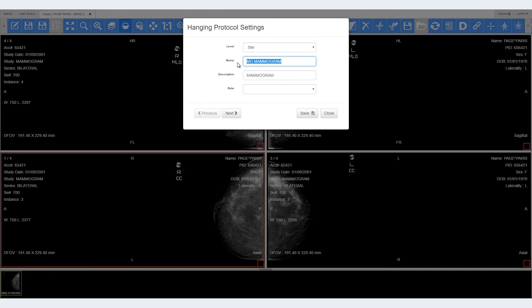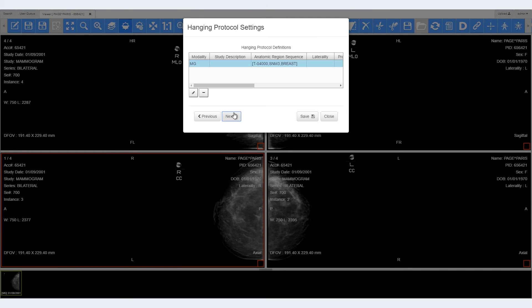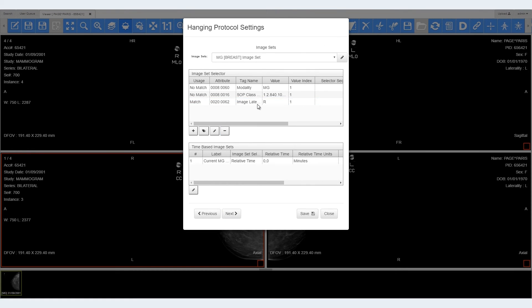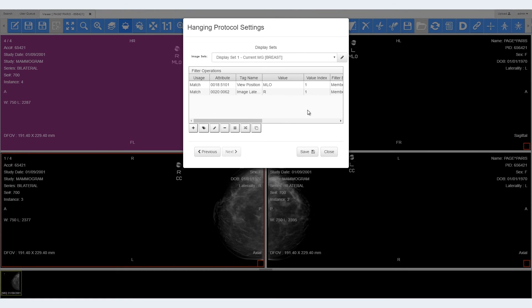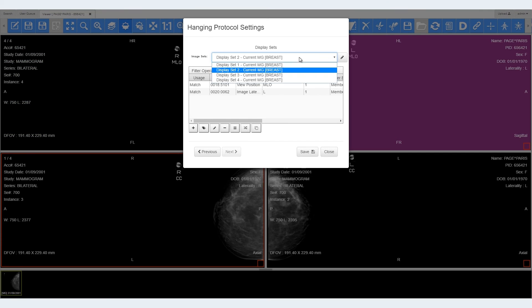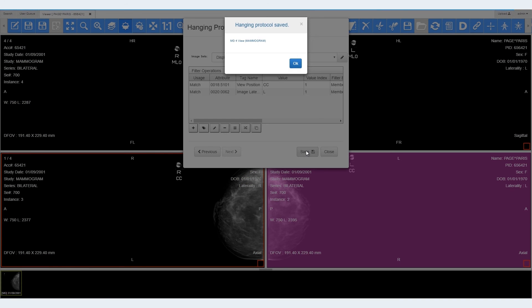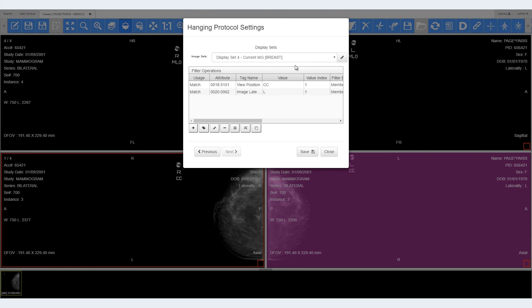In addition to the layout, many options can be configured when creating hanging protocols, including study date, modality, image laterality, view position, description, and more.